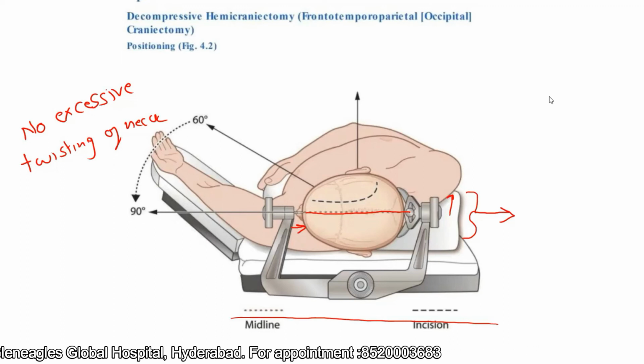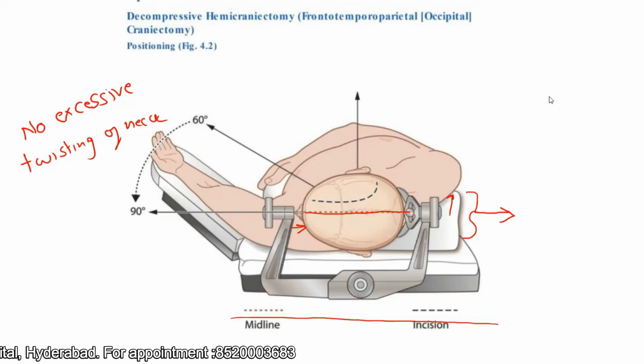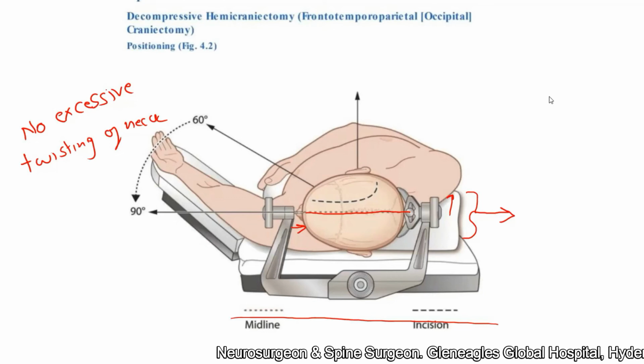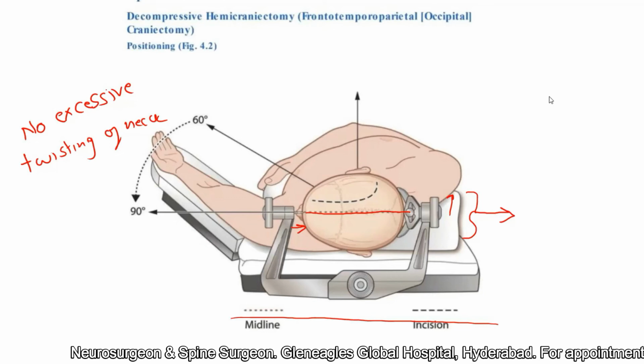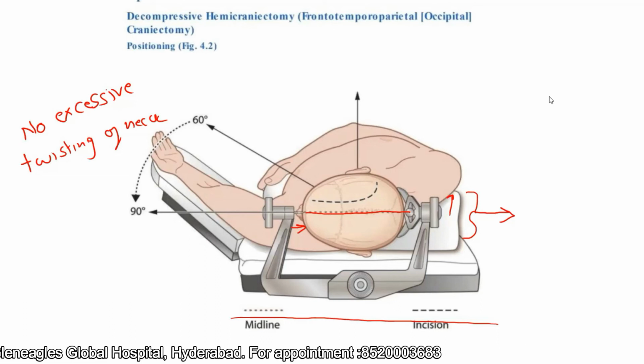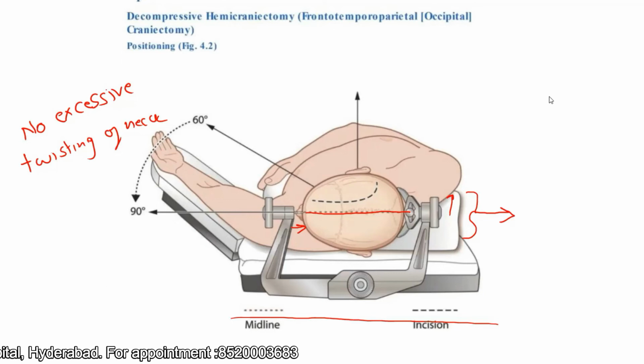This is for 2 things. If I place it in the middle, I may enter into the superior sagittal sinus if I penetrate the skull, which is catastrophic. Secondly, if I place it just above the supraorbital ridge, there is every chance that I can enter into the frontal sinus. So I place it in the mid-pupillary line on the opposite side, about an inch above the supraorbital ridge.